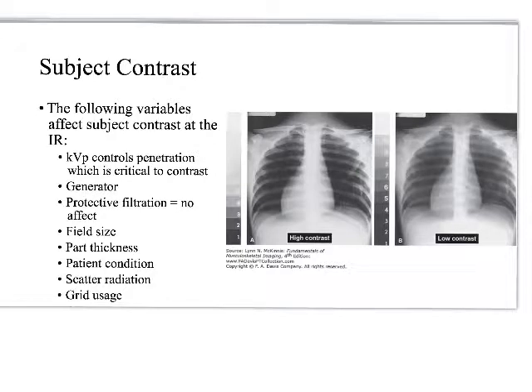So did I just lose anyone on that one thing? Okay, good. Let me pause. But I think that y'all are doing well. We're getting a grasp on this. All right. Well, in a similar way, the generator has some influence on contrast because the generator affects that average KVP. Like what we talked about with the half value layer, the exact same thing is happening with our generator.